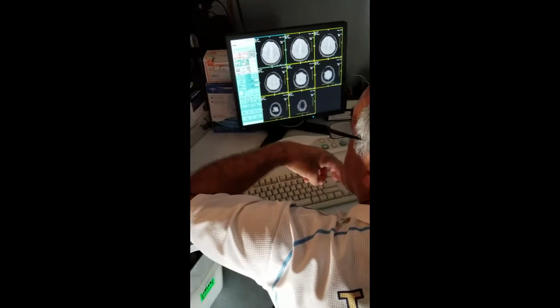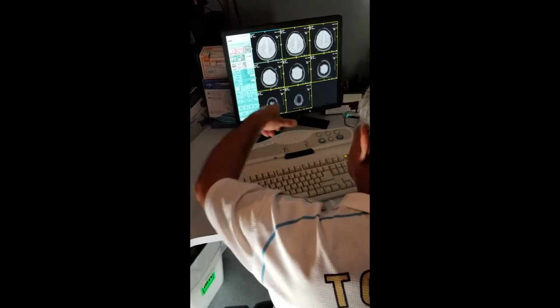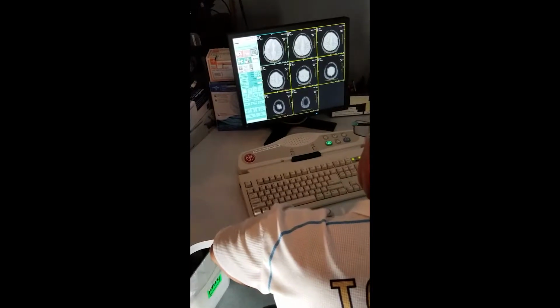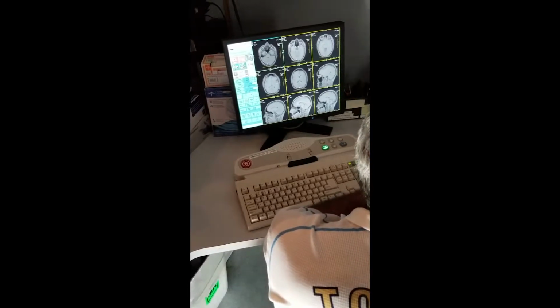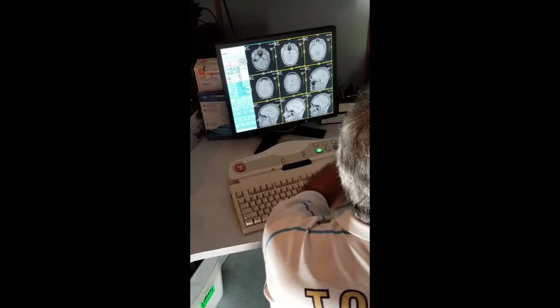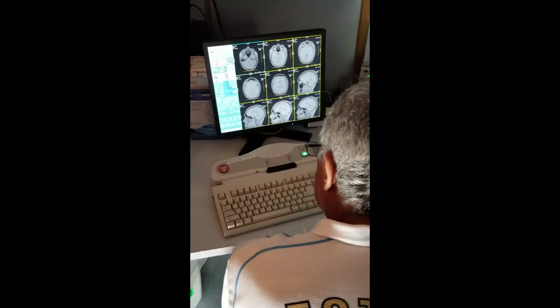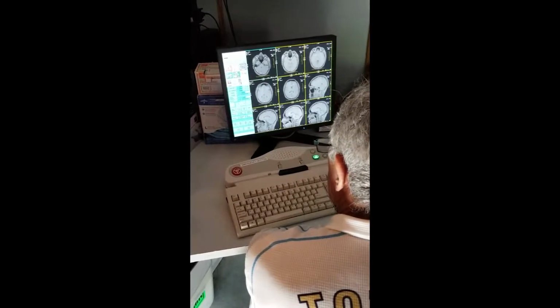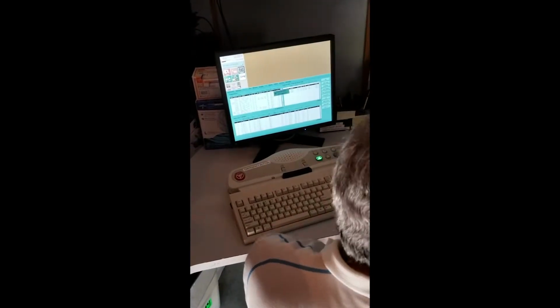Show me the coronal. Okay? Or show me the sagittal. These are located because we said this is sequence 1. So if I go next series, it's going to show me what? Next series. Which sequence was where? Sagittal was first, axial, coronal, then axial gradient. Right? So, do I click here? I don't know what the hell I'm doing here. I'm lost. So you go to browser, you go sagittal, view. There are many ways to go. Okay?